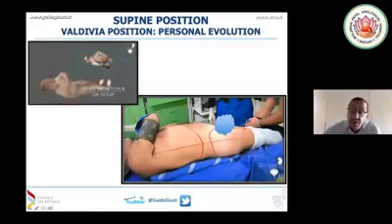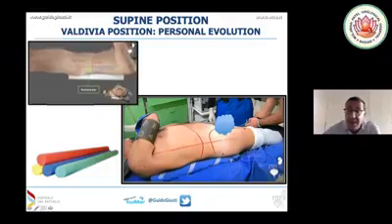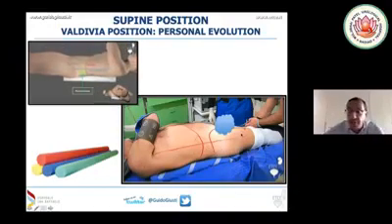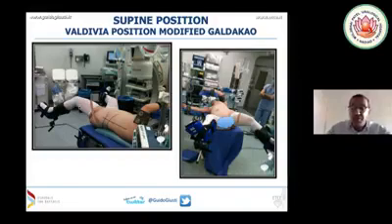So this is my position actually. You see that I don't use the water bag anymore, but I use this swimming noodle all along the flank. And as you can see, the rotation is very, very mild. This is for normal PCNL, but the position is the same also in case of endoscopic combined intrarenal surgery. You see again the swimming noodle, but only the legs on the stirrup. And now you will see the position that I developed just last year with my coworkers.